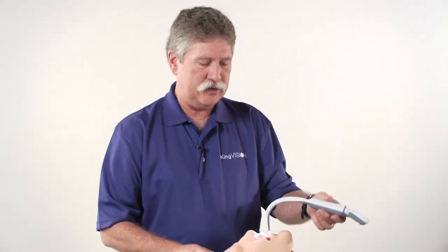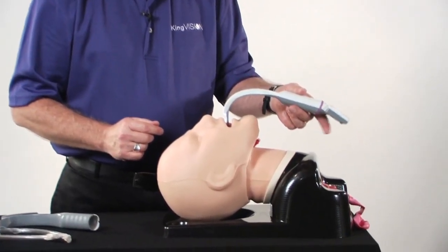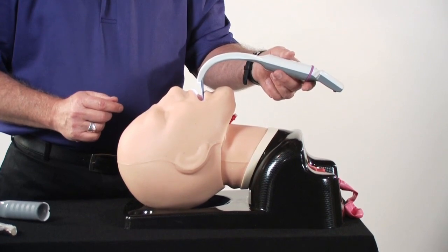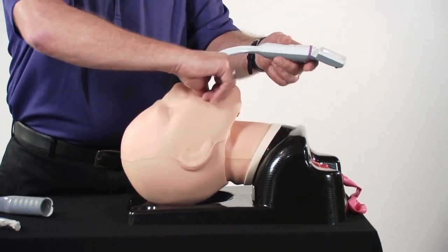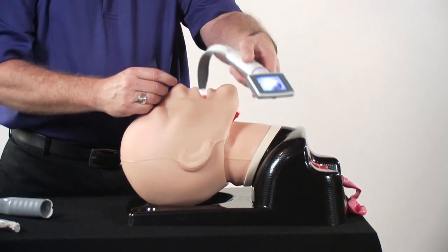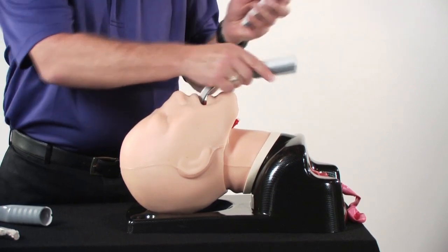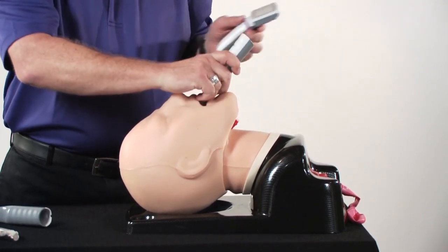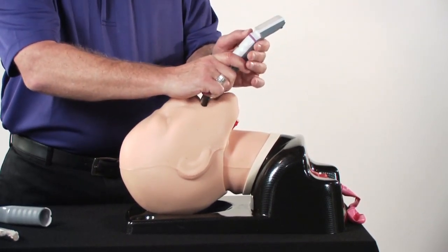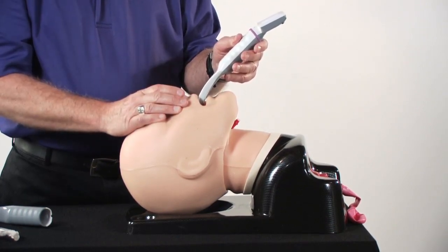In introducing the King Vision Video Laryngoscope blade into the mouth, there is sometimes difficulty with someone with a large chest where the screen may contact the chest. There are several things you can do: if you can open the mouth a little bit wider, follow the base of the tongue, you can also rotate in from the side. Or in extreme situations, you can actually introduce the blade first, then attach the display before powering up and visualizing the vocal cords.